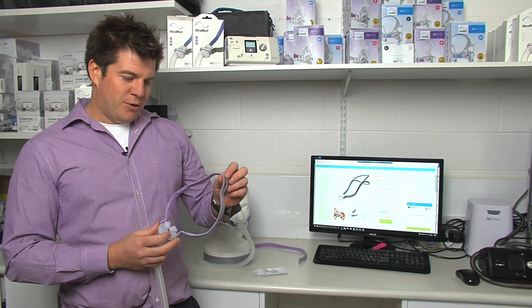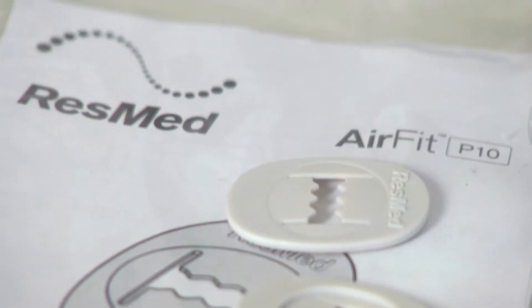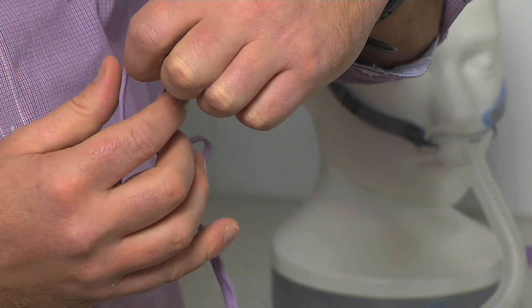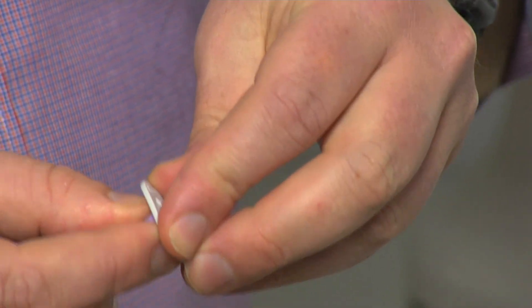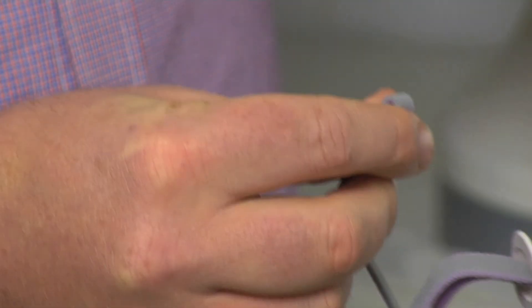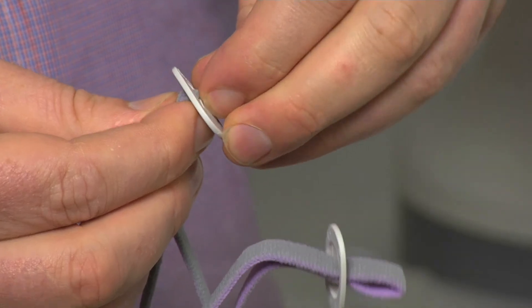What you may find after a couple of months is that the headgear may stretch, but thankfully now we have these clips available which will tighten your mask up. To use these clips, simply get your headgear into a loop and slide that through the clip, pulling it through — and one for the top strap. Adjust these clips according to your needs.